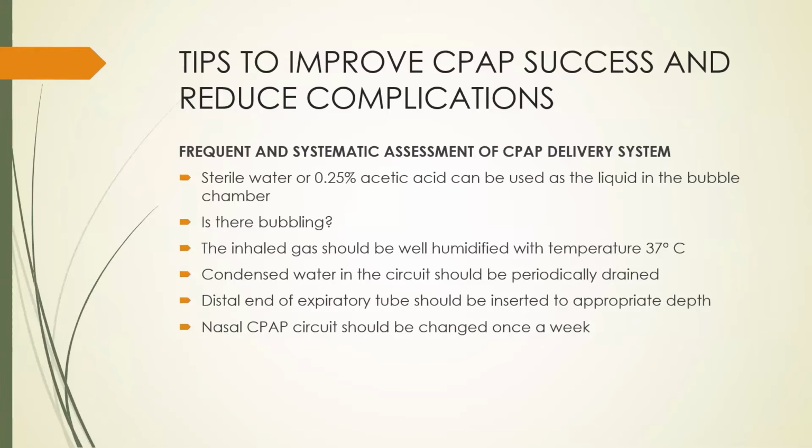Condensed water in the circuit should be periodically drained. The distal end of the expiratory tube should be inserted to appropriate depth at all times. Nasal CPAP circuit should be changed once a week.